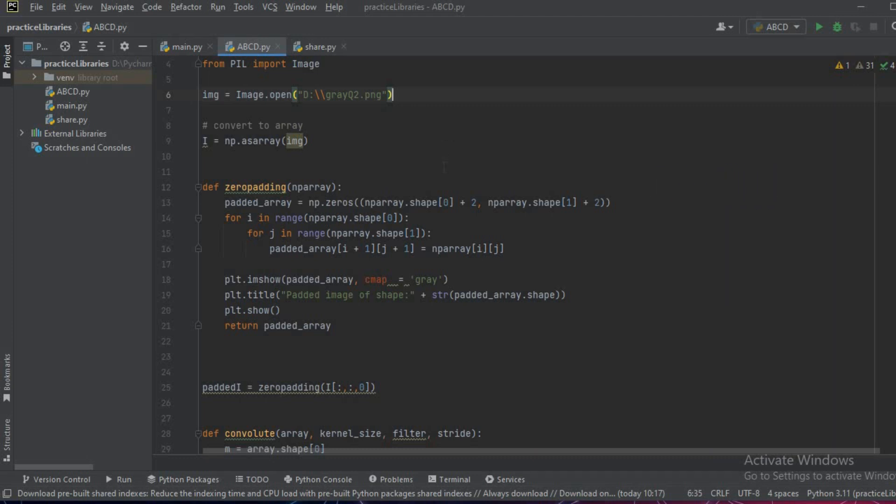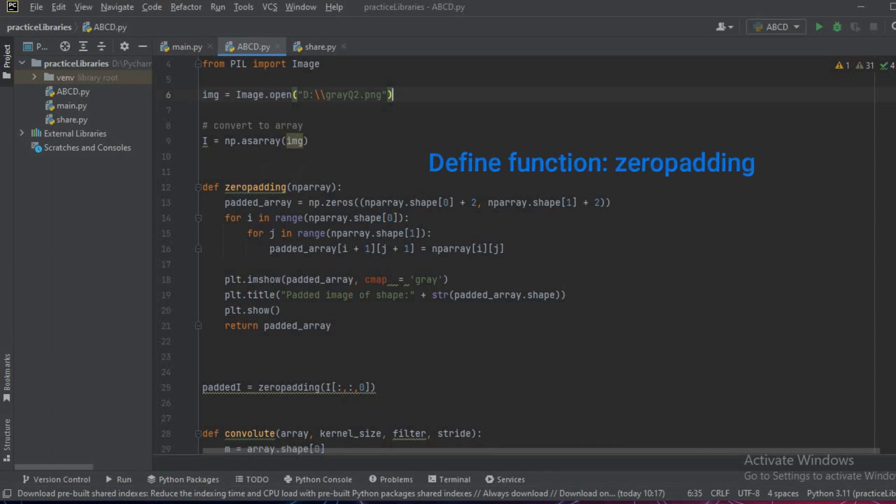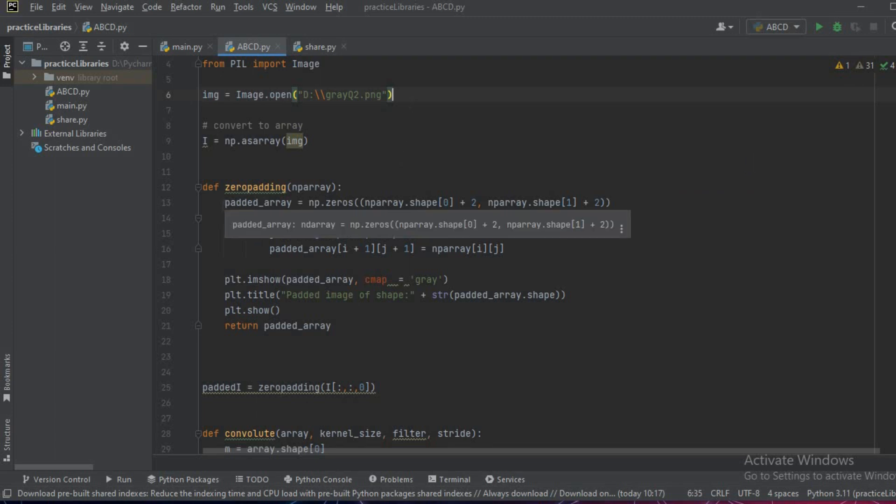Now to do the padding, we'll write a padding function. We'll write def zero_padding and we'll pass the array which needs to be padded.